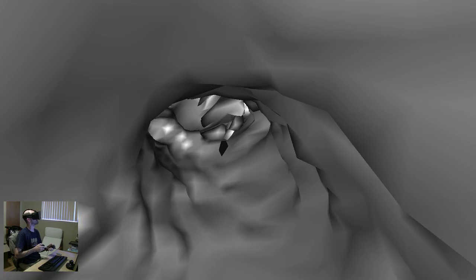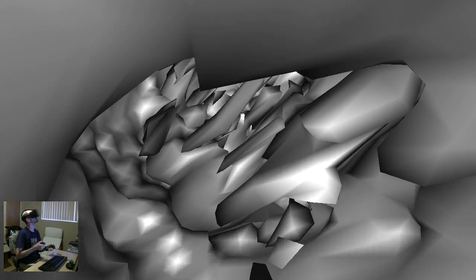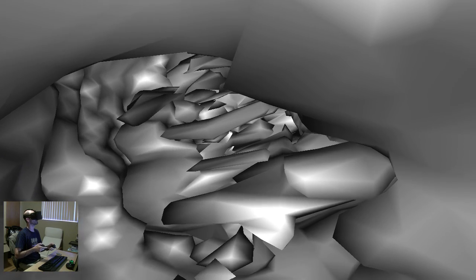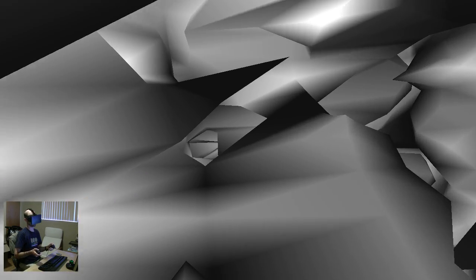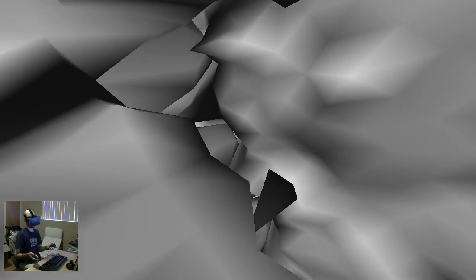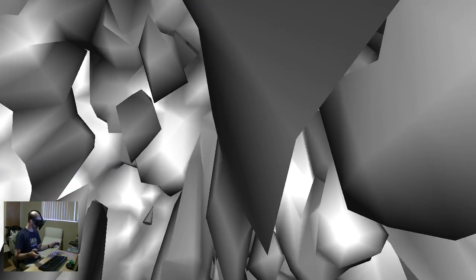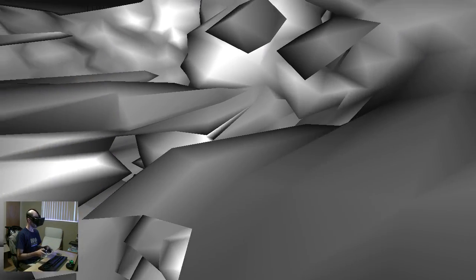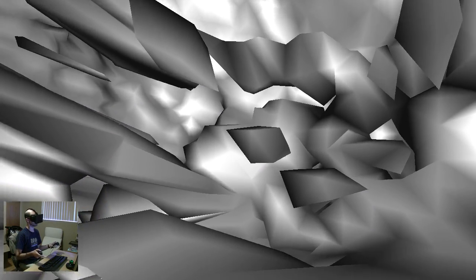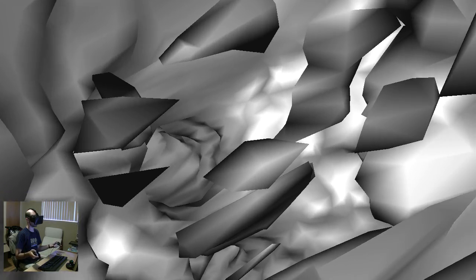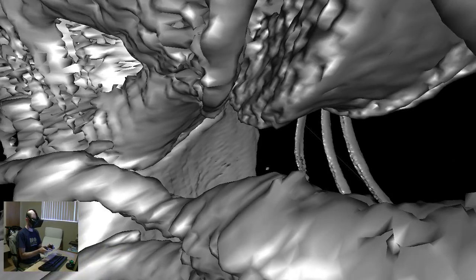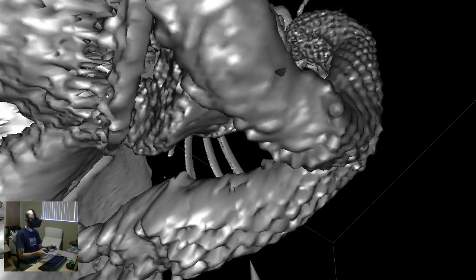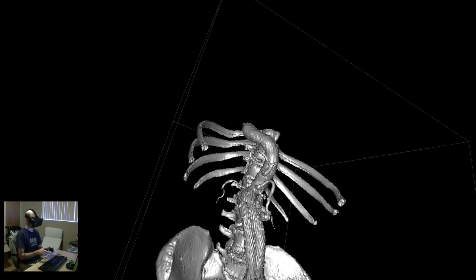And this is essentially the way how virtual endoscopy is done. You take a CAT scan, and then instead of sending a camera up somebody's artery, you do it virtually from the CAT scan. So here it looks like I'm now inside the stented area. What we have here is hopefully not arterial plaque. What we have here is just artifacts from this part of the model being surrounded by metal. And CAT scanners don't react to that very kindly. And yes, guess what? We were right inside the stent. So that's what happens.